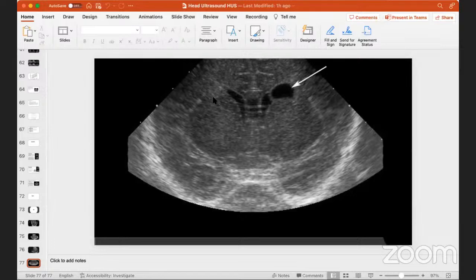And if you start doing the ultrasound, it is always better that you have a senior or at least the radiologist who will guide you, because there are certain prerequisites to doing an ultrasound. The baby should not be disturbed. You should not press the probe too hard. The gel should not be cold. Of course, hygienic measures have to be taken, clean the probe, and do not make the baby cold. So my advice would be, as I will share in the group, identify the structures and see the pictures first, try to orient yourself, and then slowly start learning.